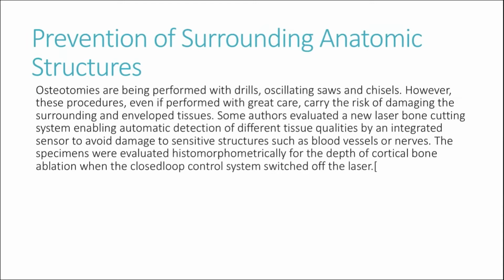Osteotomies, the bone cutting operation, are being performed with drills, chisels and oscillating saws. However, even when this procedure is performed with great care, it carries the risk of damaging the surrounding and involved tissue.